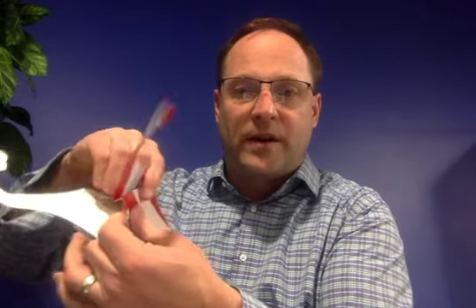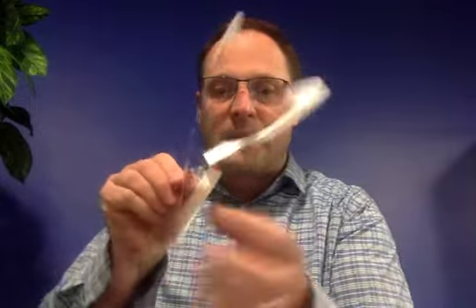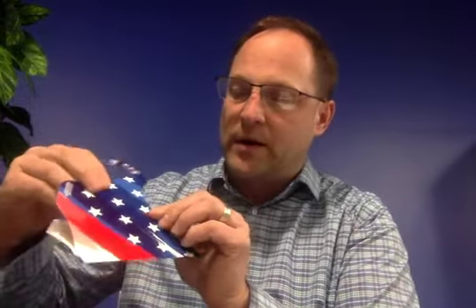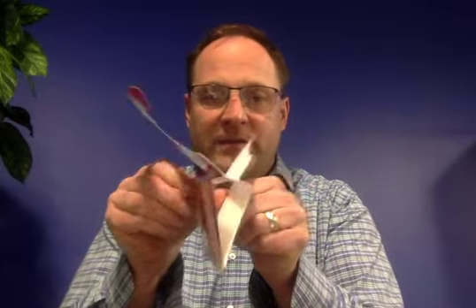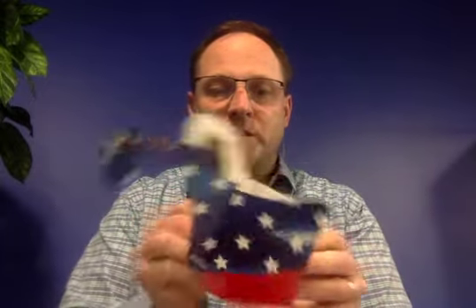So when I've folded those lines, again, the top one I fold down, and then I fold the next one like an accordion. And when I'm done, it looks like a little Z shape. I'm going to do the other side as well. So I'm going to fold that over, and I'm going to fold it back with the other line. And when I'm done, both sides should have this little Z shape. So what this will do is it allows it to fit somebody's face and then adjust for different sizes, right? So for a smaller face, this would be a great fit.